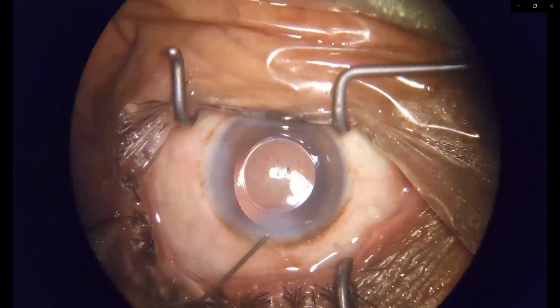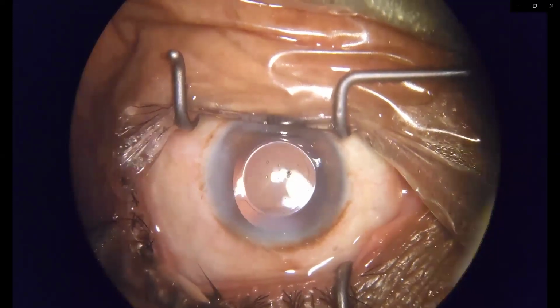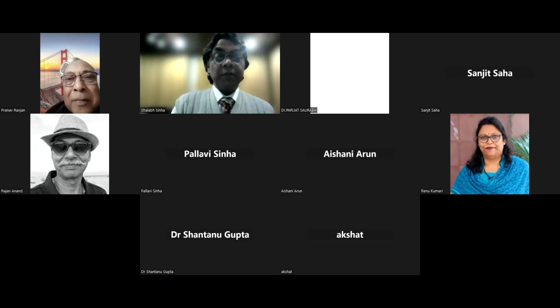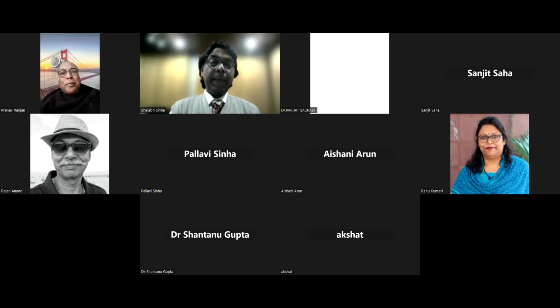No, that's not a fact, because you are going to hydrate the wound anyway, right? Even if you don't hydrate, once you're stretching, it causes more astigmatism than a clear cut by the incision knife. So a clean knife incision will cause less astigmatism than stretching and then tearing. It's like you do an episiotomy and the delivery, versus delivery directly without episiotomy. Yes, that's right.